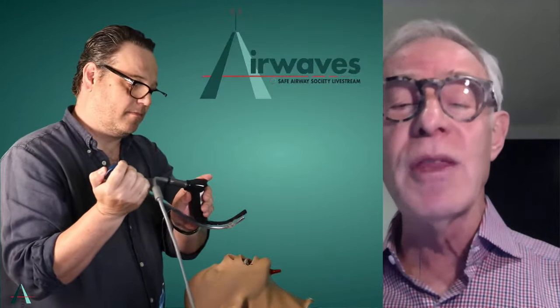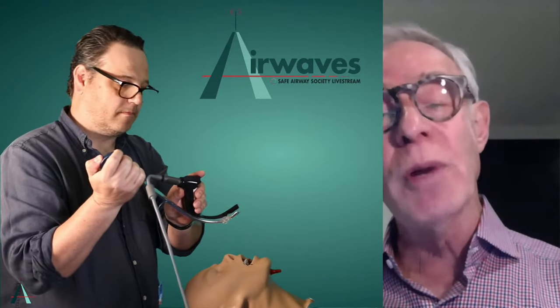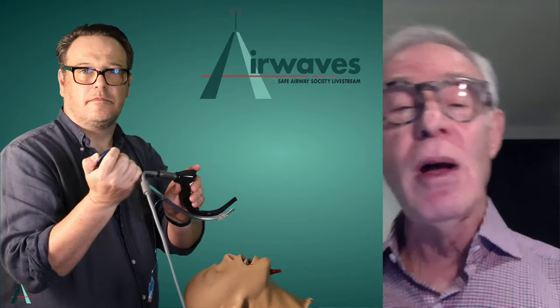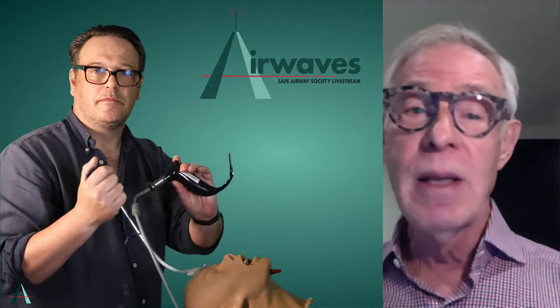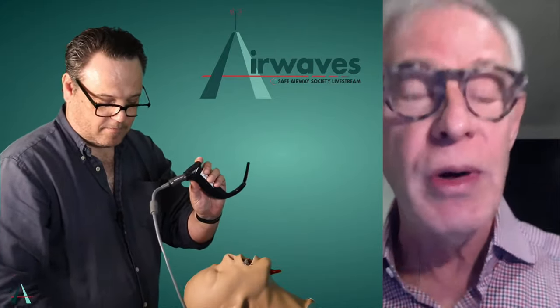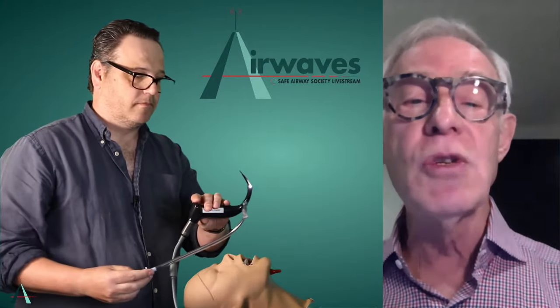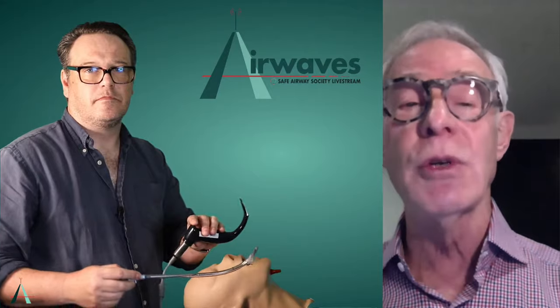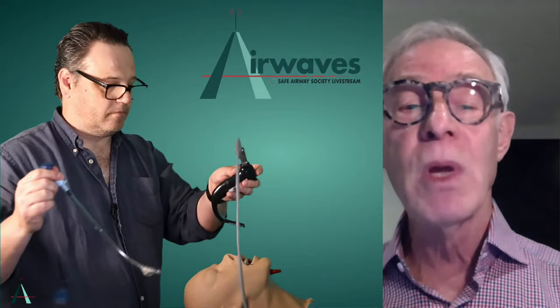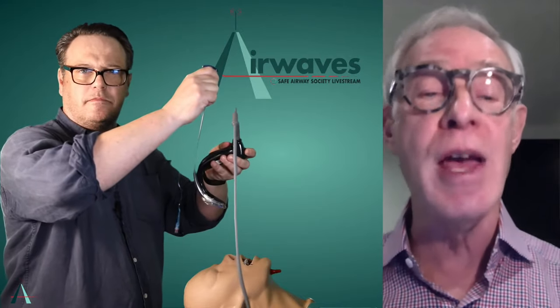And I think we did a poor job of describing that, because although it conforms to the very distal tip, a lot of people end up having a huge angulation on their blade, on the stylet. And that only complicates things, because you get too anterior in your delivery and you get engaged on the anterior tracheal wall.